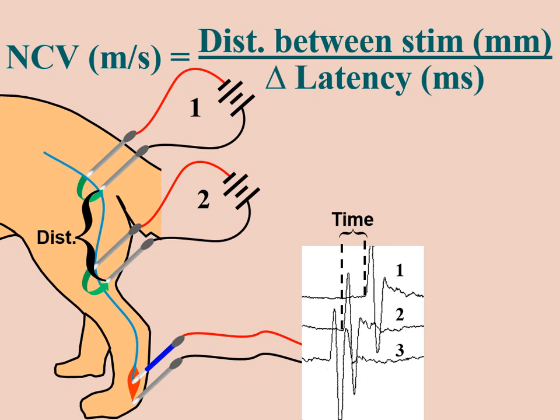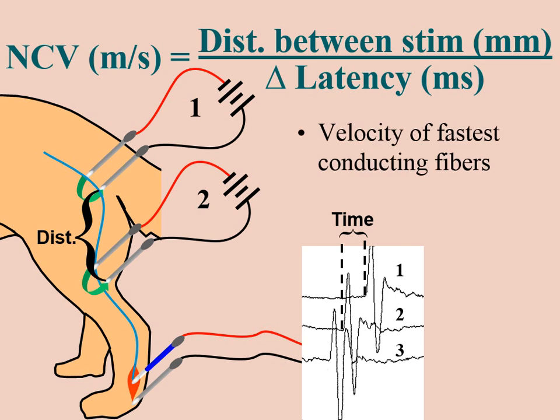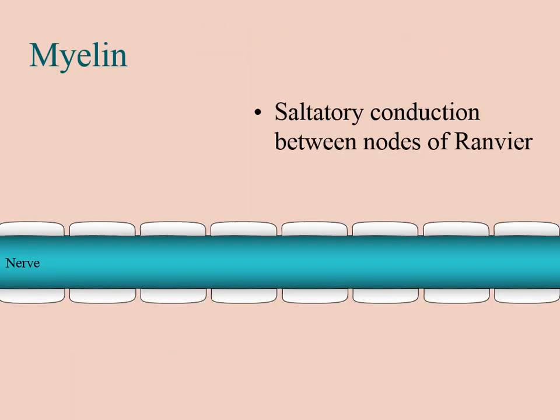And so if we divide that distance by the difference in latency, in millimeters and milliseconds, we come up with a conduction velocity in meters per second. And that's, again, the fastest conducting fibers in that complex.